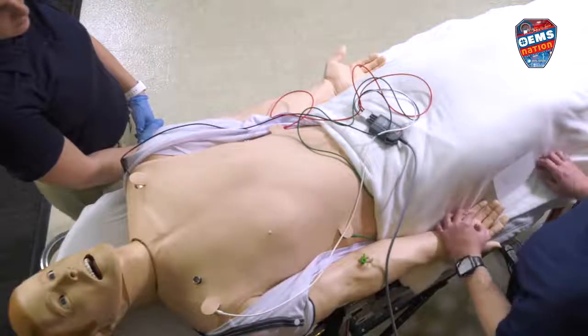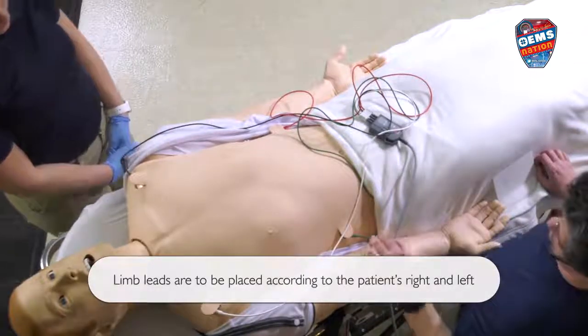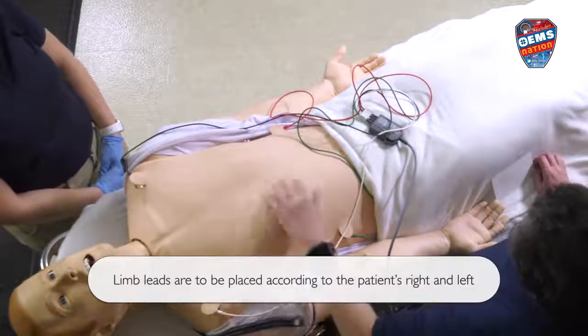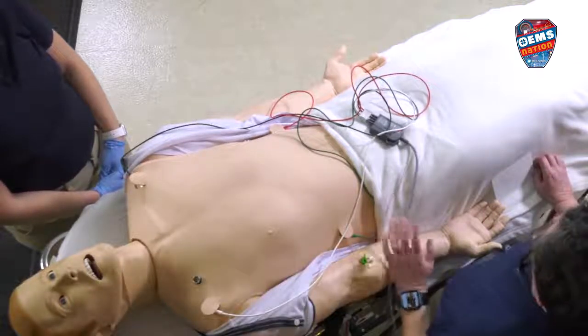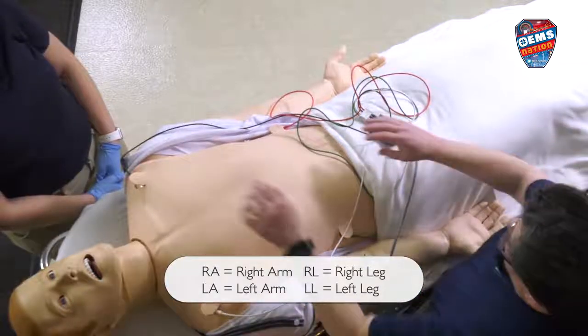Already on our mannequin here, we have our limb leads. For EMS in the field, we usually put it on the core because it has less interference that way. So we have four leads over there.